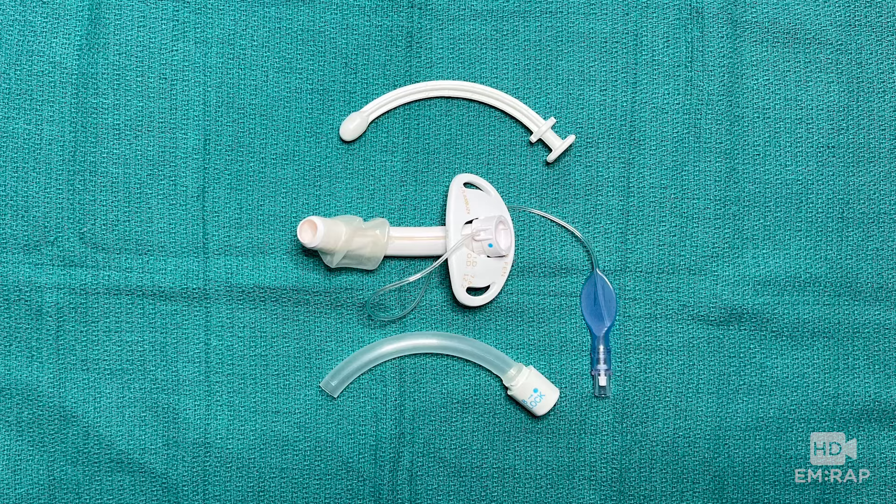I'm Dr. Jess Mason and it's time to demystify the tracheostomy tube. This one happens to be cuffed, and here's the pilot balloon — when you use the 10cc syringe to inflate it with air, that cuff inflates.